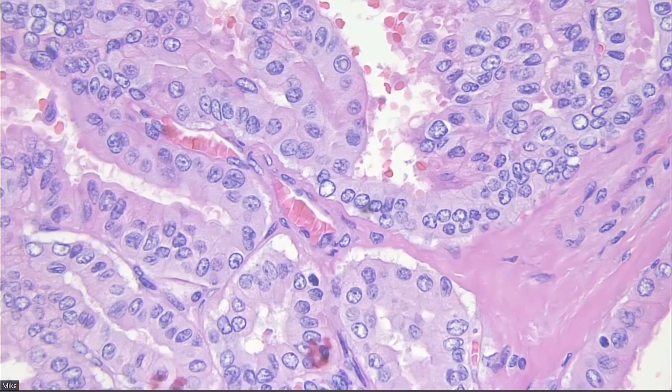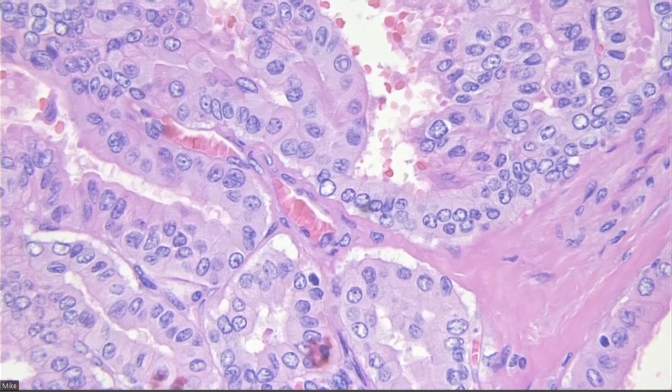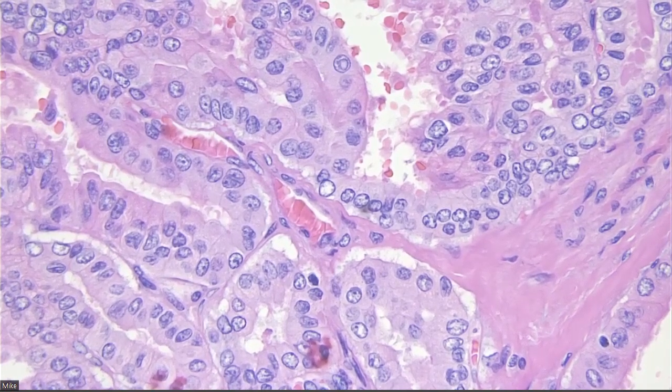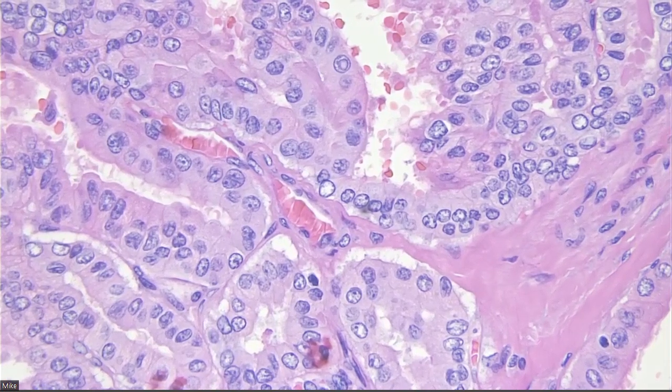The only time I allow pseudo-inclusions is that sometimes oncocytic neoplasms can have them because they have convolutions in their nuclear membranes. But you should have other things that remind you of oncocytes, like granular cytoplasm, big nuclei, big nucleoli, which this doesn't have, right? This has PTC, real PTC nuclei, all right?